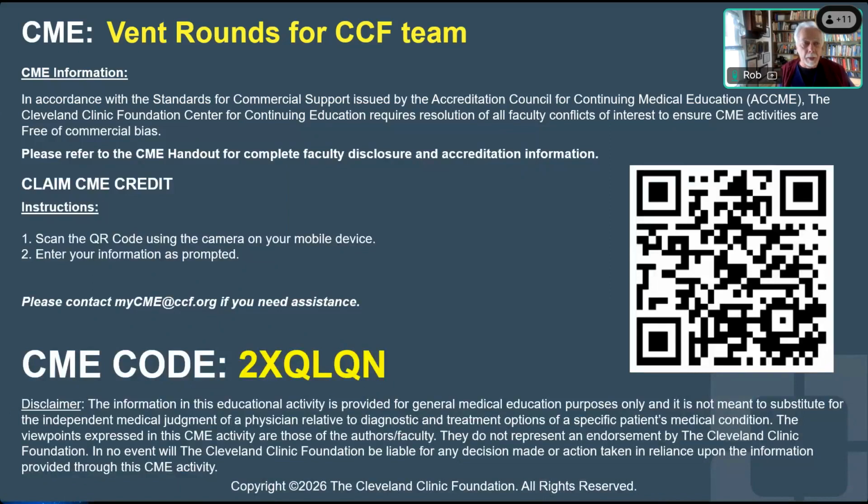So with that, I'm going to conclude. Eduardo, are there any take-home messages that you want to convey? Evidently, there are free simulators and others that are not free. The ones that we have highlighted here are free: the one by Tom Piraino, Safadi's, and the Hamilton one. There are others out there. This is just a sample of what's available. We're not endorsing anything, we're just sharing what's out there and what we liked and didn't like.